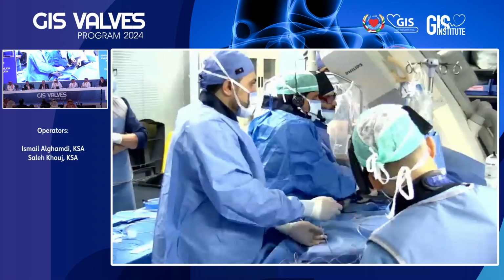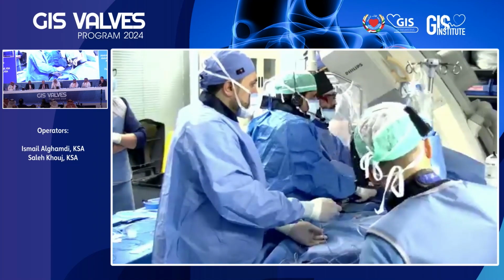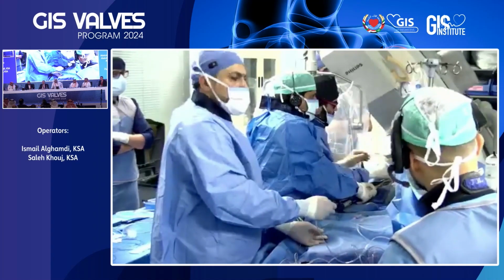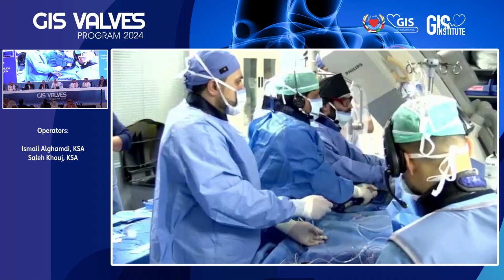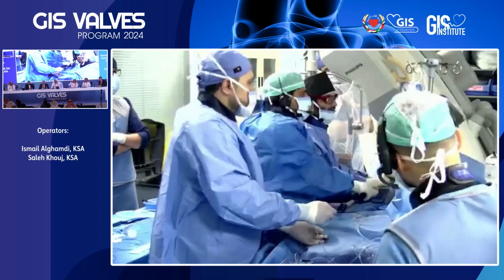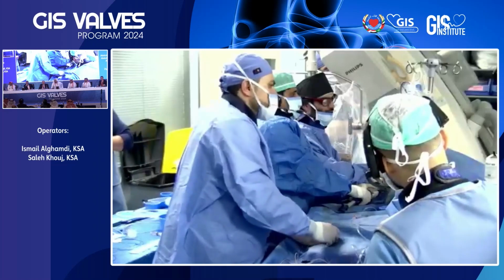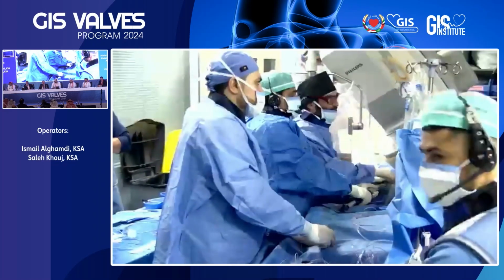Dr. Saleh, can you ask the cameraman to show us the screen, please? Sorry, Dr. Saleh, I interrupted you. Yes, show us the screen, please. We can only see your hands and the femoral access. Dr. Faisal, can you see the screens? We see you very well, and we just want to see the screen.